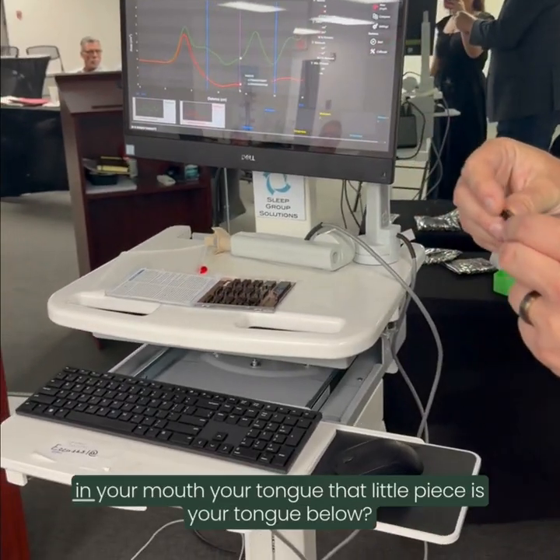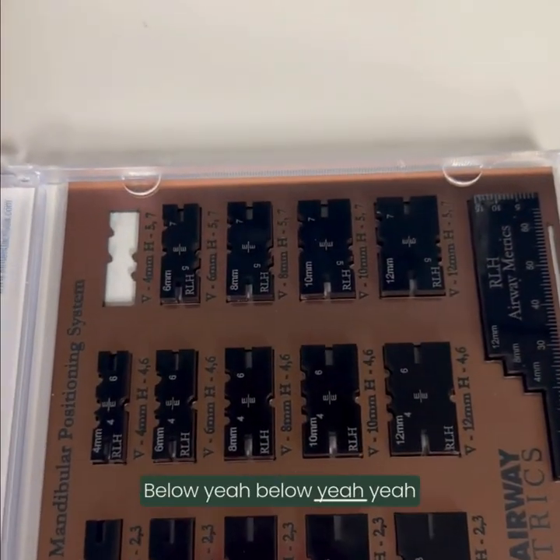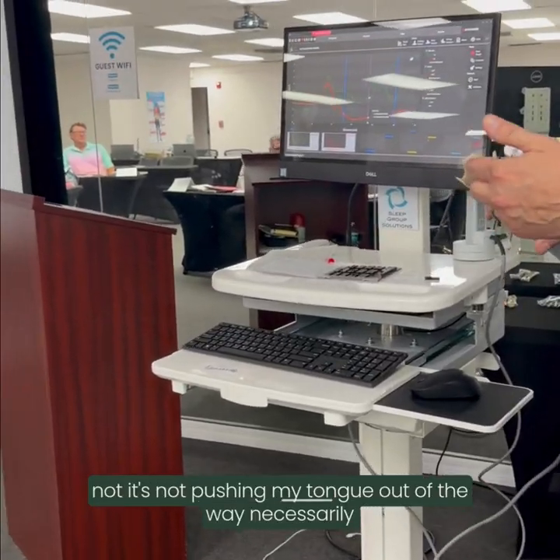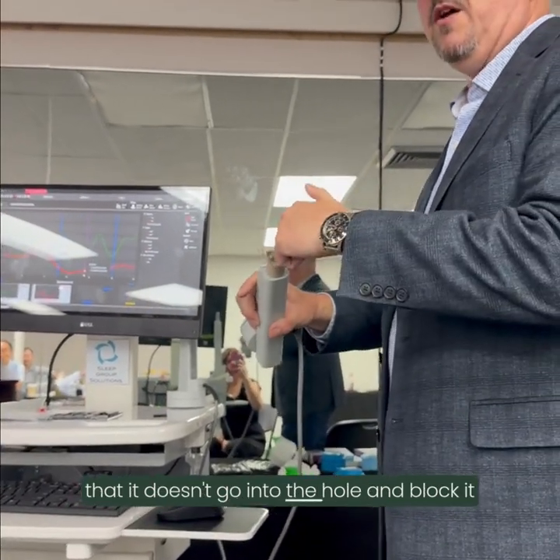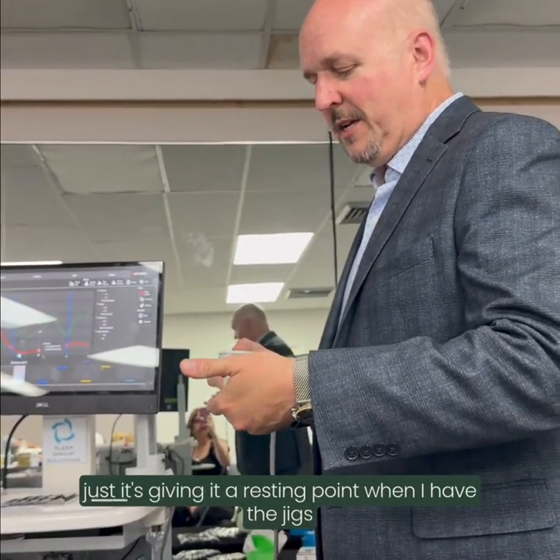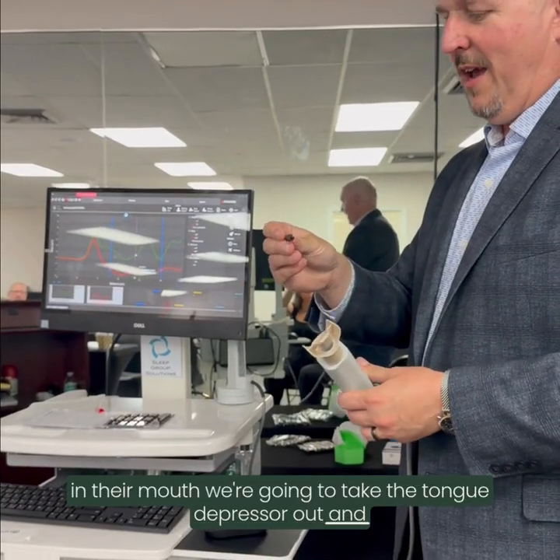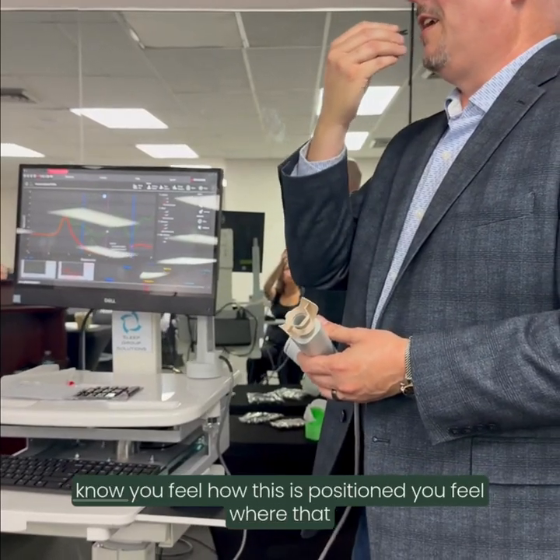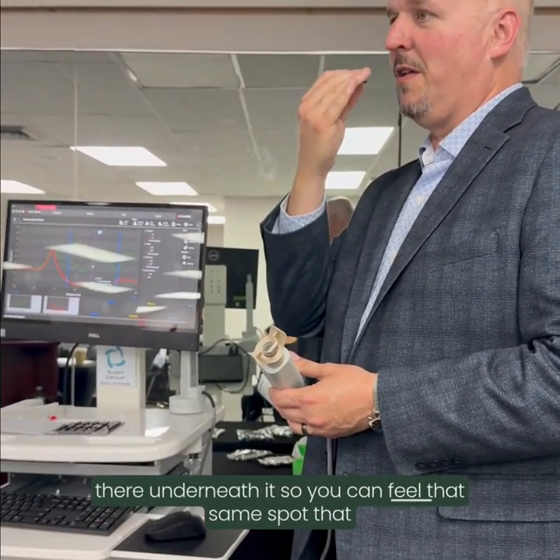John, when you put the mouthpiece in your mouth, that little piece, is your tongue below or above? Below, yeah, below. Tongue's below. It's not pushing my tongue out of the way necessarily. It's really just giving your tongue something to do so that it doesn't go into the hole and block it. Or to go back. Yeah, it's giving it a resting point. When I have an airway metrics jig in there, I always tell them, you feel how this is positioned, you feel where that is with your tongue. I want you to keep your tongue right there underneath it so you can feel that same spot.